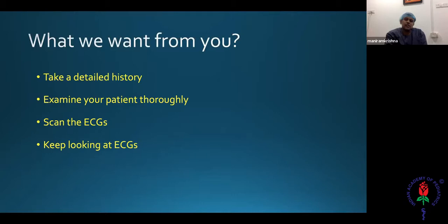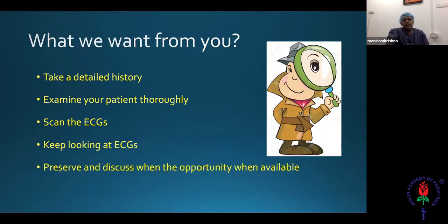And even if you don't know the ECG which you come across, scan the ECG or take a very good quality photo of the ECG. I always recommend scanning the ECGs because sometimes in the photograph, it's very difficult to get it on a flat surface and also very difficult to avoid shadows. Whereas on a scanner, you'll get a very high fidelity copy of the ECG. So scan or take a photograph, whichever is feasible for you, and preserve them. And whenever you get an opportunity to discuss it with the pediatric cardiologist or someone who is much more well-versed in interpreting ECGs, use that opportunity and learn from them and get better at interpreting the ECG.